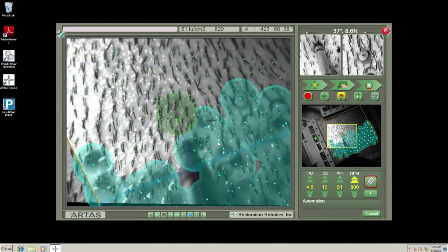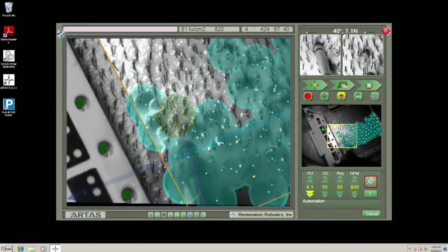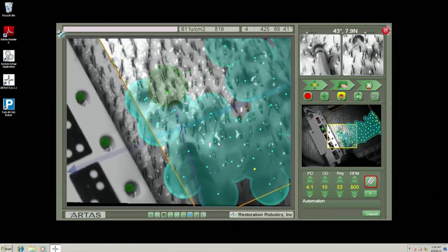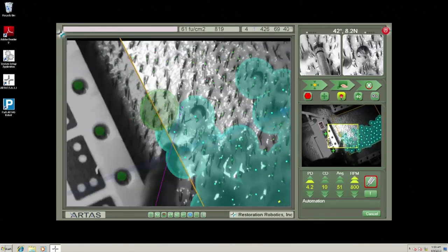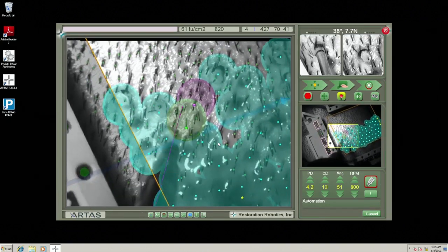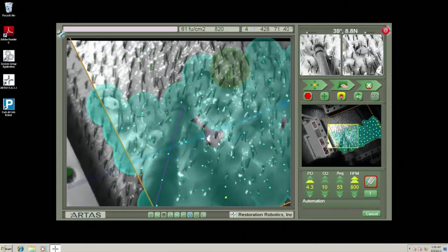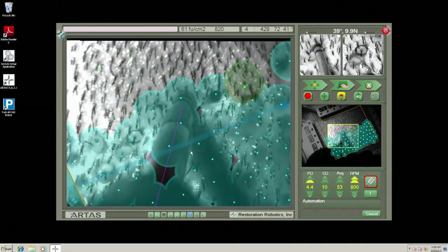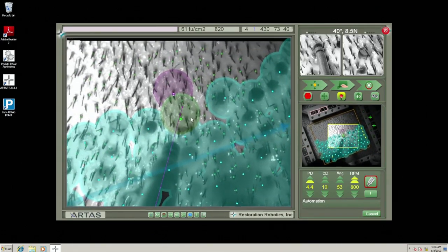So I'm just going to tell you a little bit about a few things that I want you guys to look at. Now, the most important thing, coined by Dr. Jim Harris, who led the first ARTAS symposium, is something called optimal graft elevation. When we look across the field of dissection, we're looking at whether these grafts are elevated in their holes. Are they coming up? Do they need more dissection?